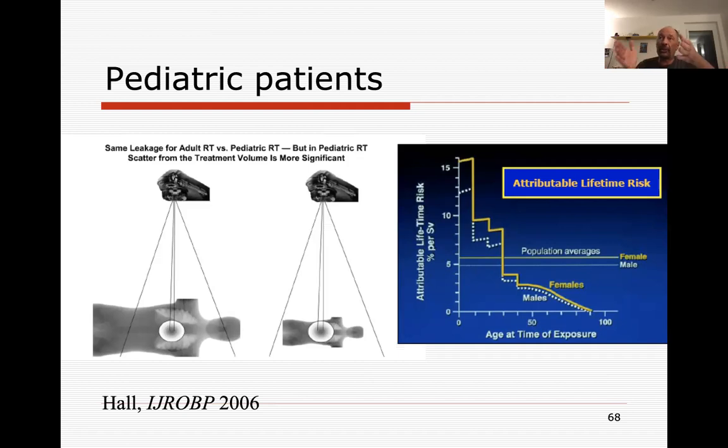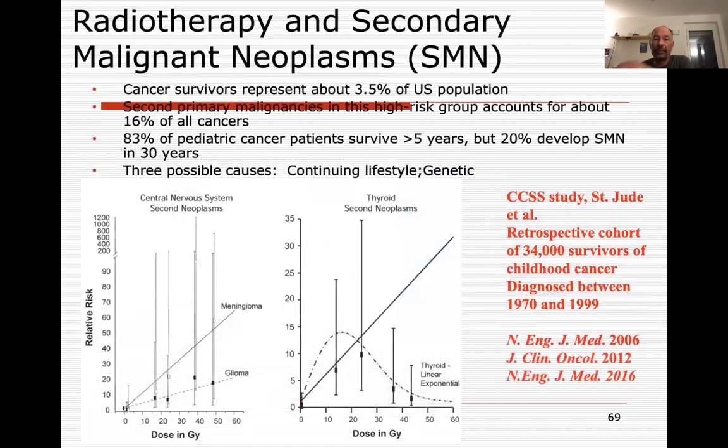When you have irradiation, you have leaking, the stray radiation, which is radiation which is leaking, not going straight, but going in this direction. This is a relatively small problem when you have an adult, but when you have a pediatric patient, this means that you practically irradiate almost the whole patient with stray radiation. So you can also have a lot of out-of-field tumors.